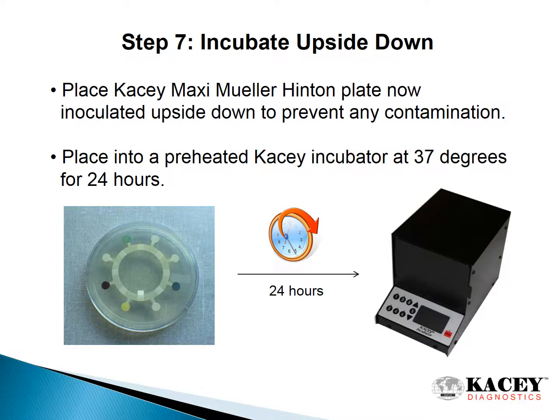Step 7. Incubate upside down. Place a Kacey Maxi Mueller-Hinton plate, now inoculated, upside down to prevent any contamination from condensation. Place into a preheated Kacey incubator at 37 degrees for 24 hours.